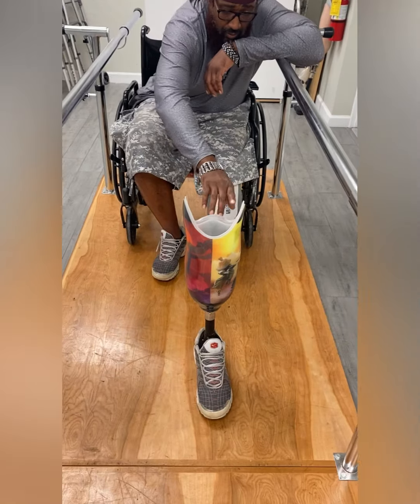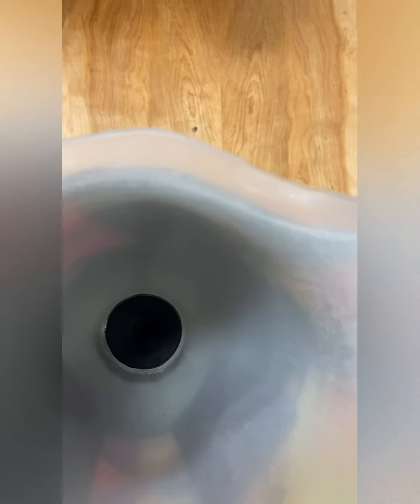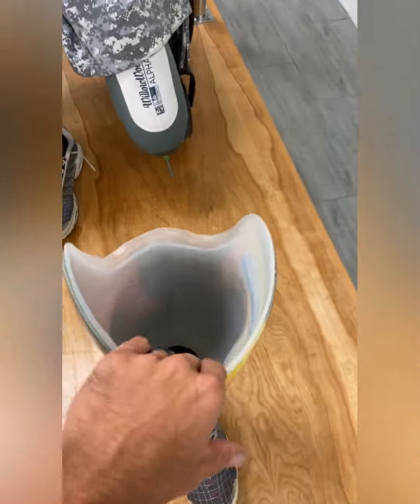Now you are ready to put on your leg. Note at the bottom there is a hole for the pin to slide in. There is also a release button on the side, which will be used to remove the prosthesis.